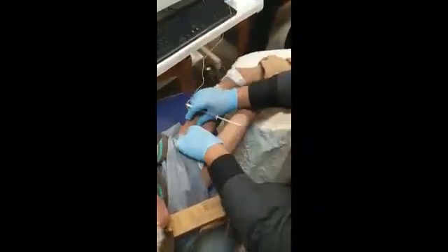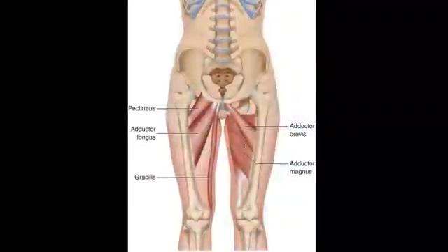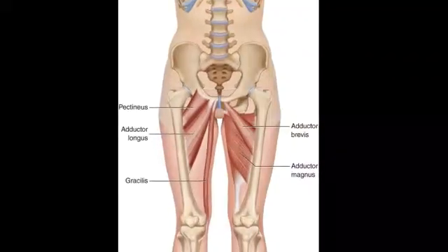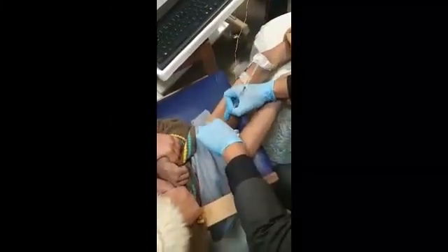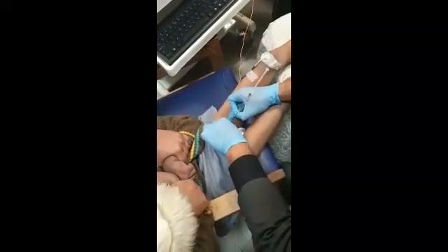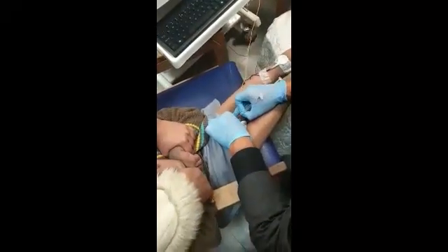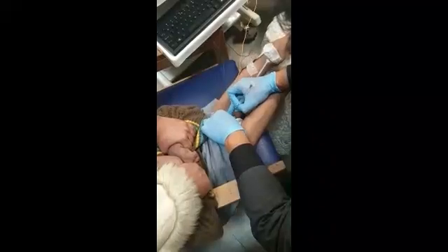Using EMG guidance, I'm injecting the left leg first. On the left leg, I'm trying to isolate the adductor muscle — the large adductor muscle which is very high and very medial, going all the way up. Proper exposure and positioning is very important. Once you palpate the spastic adductor muscle, you go right into the belly to get the Botox injection given.